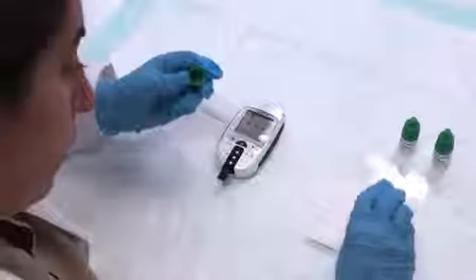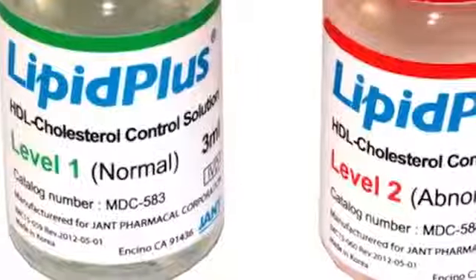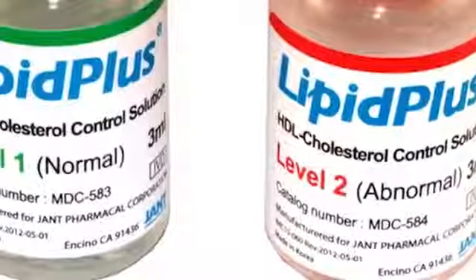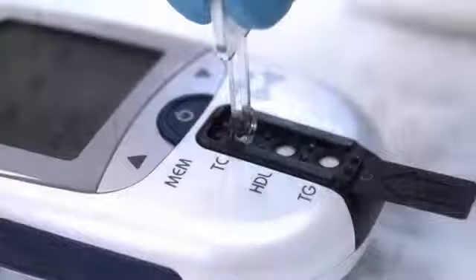When testing, dispose of the first drop of each control solution before use. Then place a drop of the total cholesterol, HDL, and triglycerides control solutions on 3 separate areas of a clean, dry surface. The normal controls should be run on 1 lipid panel strip. The abnormal controls should be run on a second lipid panel strip. Obtain a sample of the control solution by placing the tip of a single capillary rod on the drop of the control solution. Apply the control solution to the appropriate test area of the test strip using the capillary rod.